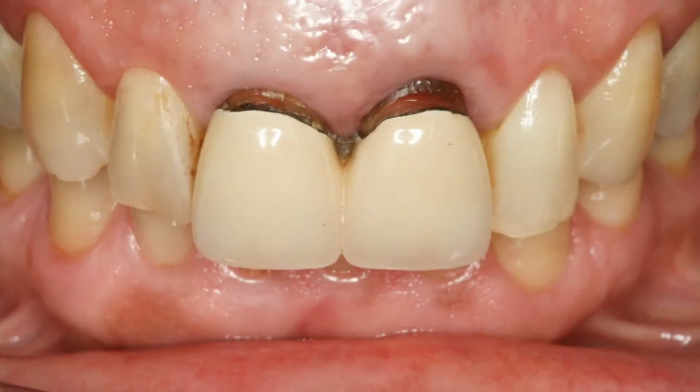The other option that was discussed was some sort of gingival surgery to balance out the gingival zenith. But given they are all potentially complex treatments and treatment time is going to be longer as well, Susie really wasn't too keen on all that. She was after something that's a little bit quicker in treatment to give her smile back. Still a good lift. Understood.